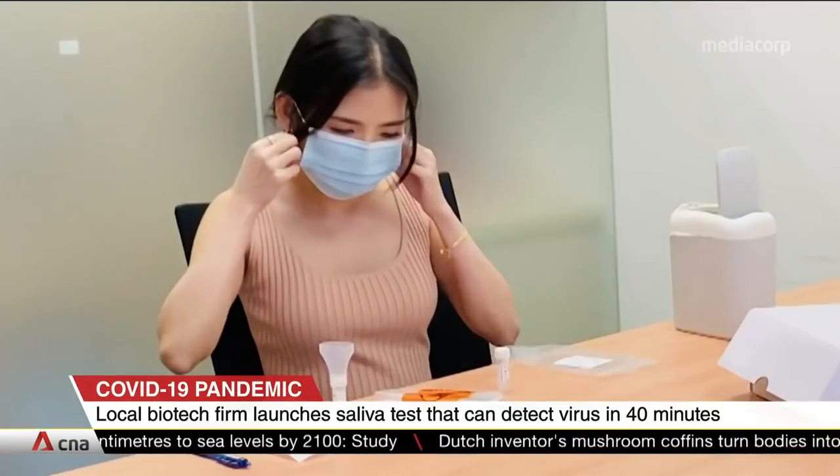There will soon be a faster way to detect COVID-19 infections using saliva samples. The test kit developed by a Singapore biotech firm takes just 40 minutes to detect the virus, compared to other kits which usually take more than an hour.